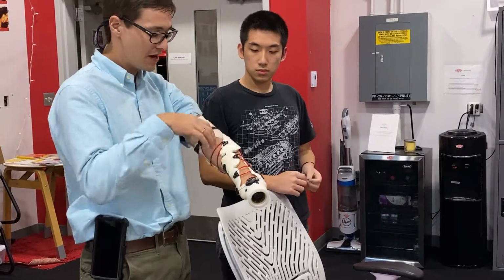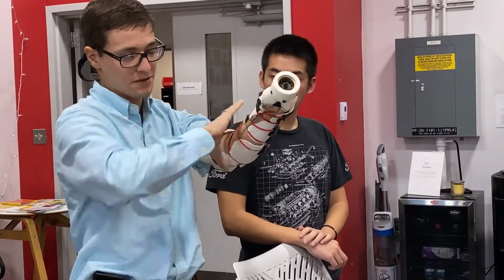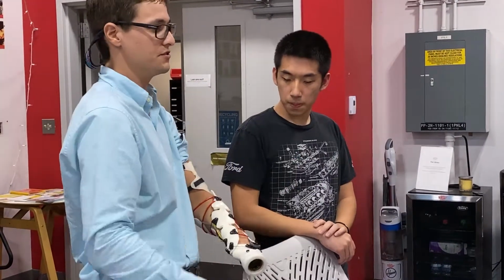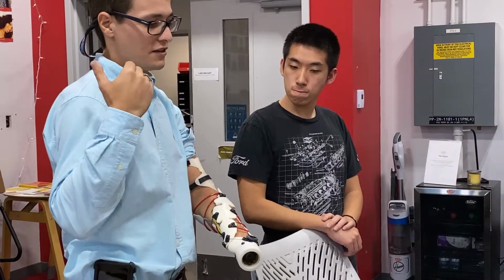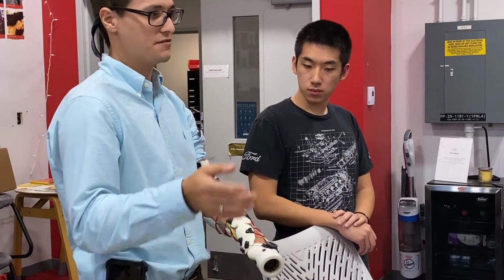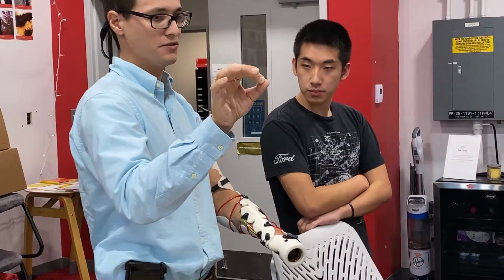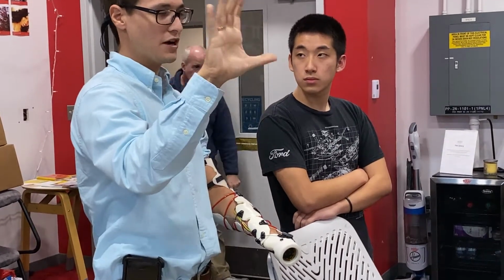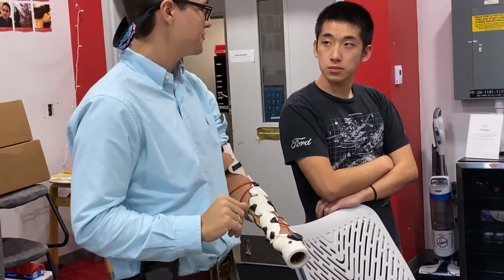The idea that Marty was mentioning is that because the rotation of the arm is limited at the bottom where the electrodes are, you don't get that displacement as much, and so you get a more accurate read. And you're not cross talking with muscle groups, so you're getting multiple degrees of freedom instead of just a single open and close. You can do pinch, pivot, or full grasps, for example. So it allows a couple of different degrees of freedom.